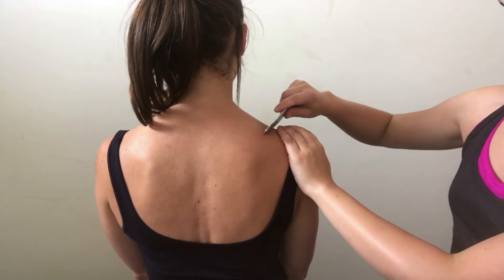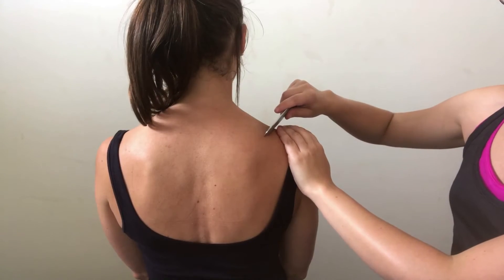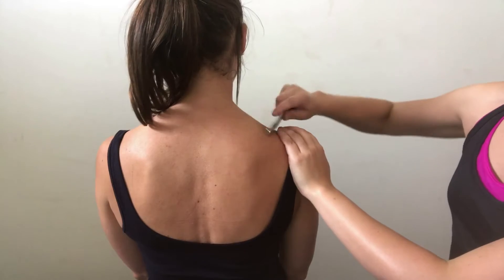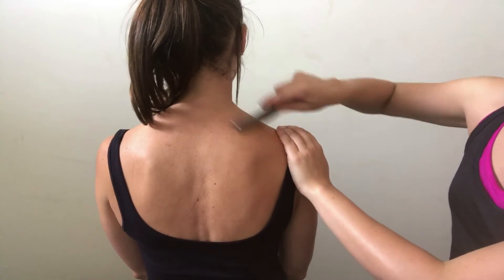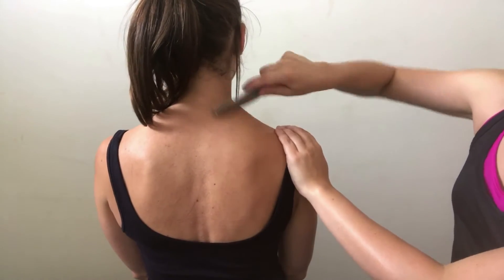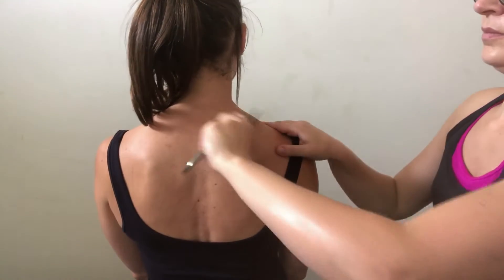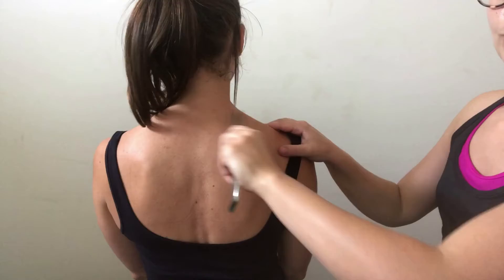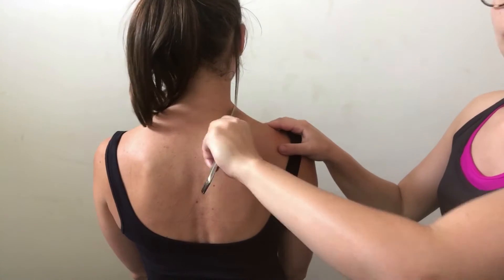Also in a side lying position, the head can be facing forwards, and then you can start to add some head and neck movements such as lateral flexion and also rotation.